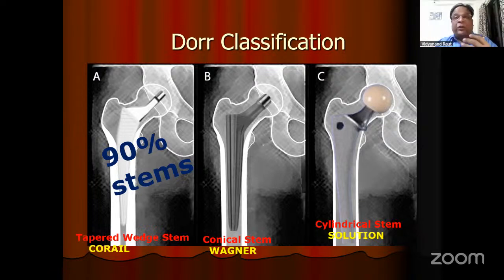was nice for shallow acetabulum. Duralock is a 160-degree cup. So it is not a complete hemisphere, less than a hemisphere. So if the depth of the acetabulum is not too much, Duralock works well. So in shallow dysplastic acetabular hips or shallow acetabulum, whatever the reason, it's a good idea to have Duralock if it's available. Most of the times for primary hips, we use Pinnacle.